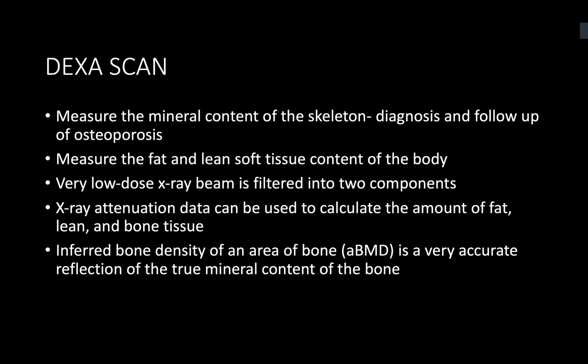Moving forward, your patient initially had the prostate surgery, then had the biochemical recurrence, which was taken up by the PSMA PET scan. You are starting him on ADT. So during the ADT, one of the concerns is decreased bone mineral density and osteoporosis. So is there any way that we can look into the osteoporotic risk of ADT? Any imaging that helps us?